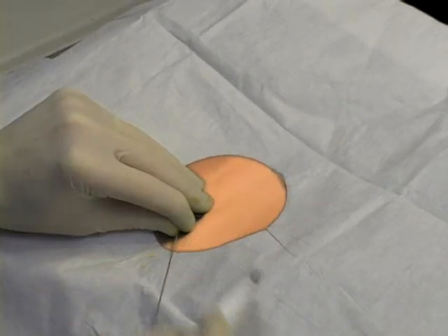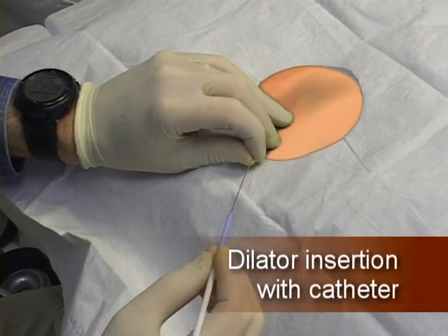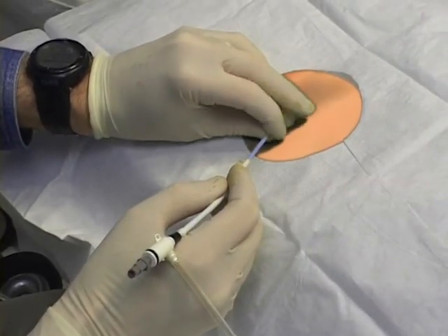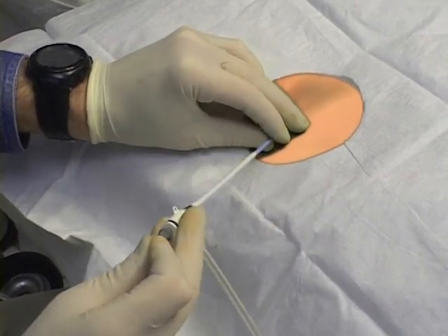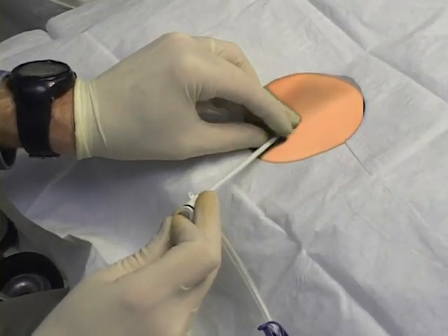Remove the insertion trocar and incise the skin with an 11 blade to allow the dilator to pass easily. Pass the catheter and dilator over the wire as shown. As soon as the wire is visible at the distal end of the catheter, release one hand from the wire proximally and grasp the wire at the distal end.